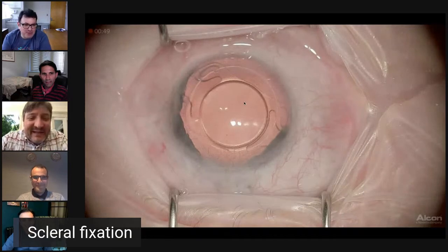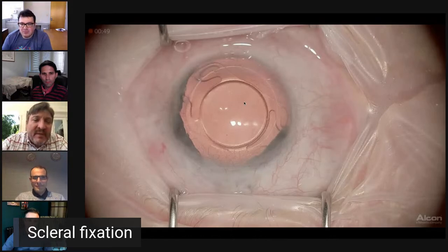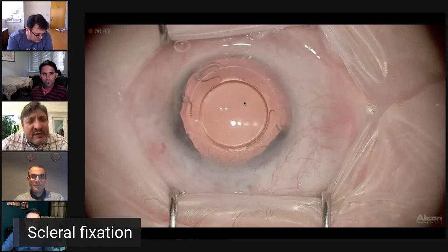Suture looks beautiful. So this here is a very, very interesting case. This is a patient that has almost complete aniridia. You see he's got an endothelial corneal transplant. He's got an epiretinal membrane that looks like maybe a 20/60, 20/80 epiretinal membrane. The cornea is clear, but the visual acuity is count fingers at his face.